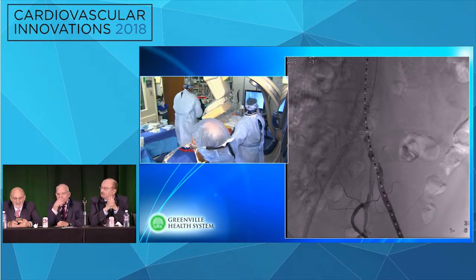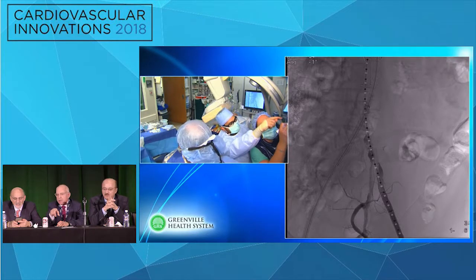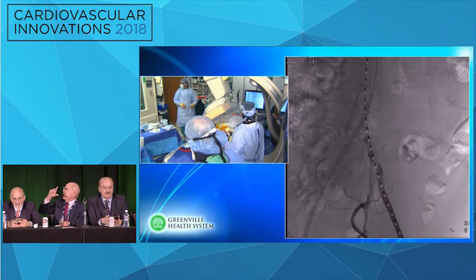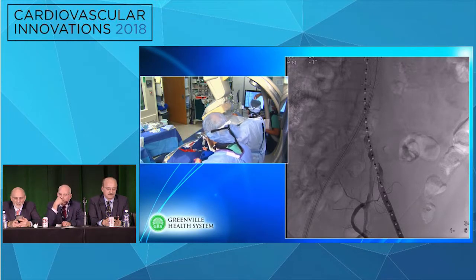16. Oh, I see. So that is the next length? 16. So it would be 10, 12, and 14. 14. So it's a total length of 8 inches. I see. So device size is 14.